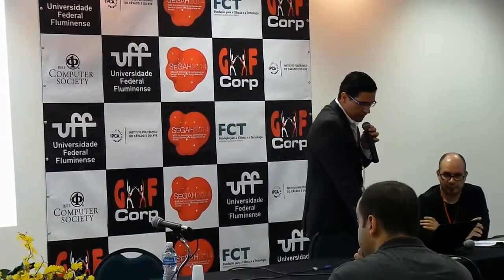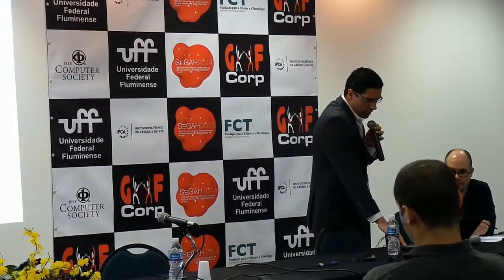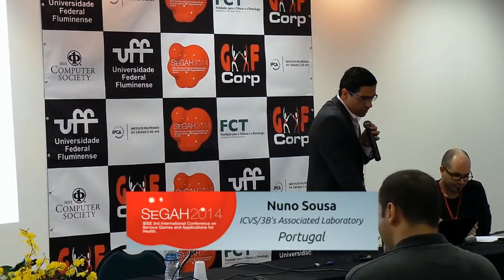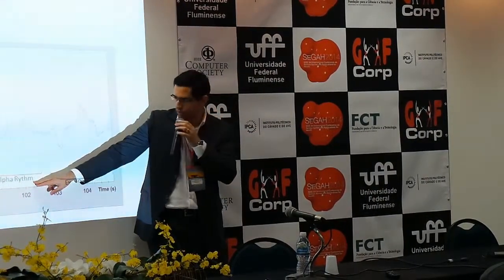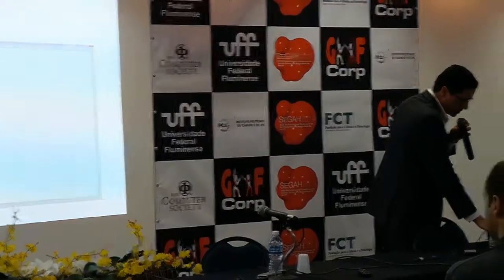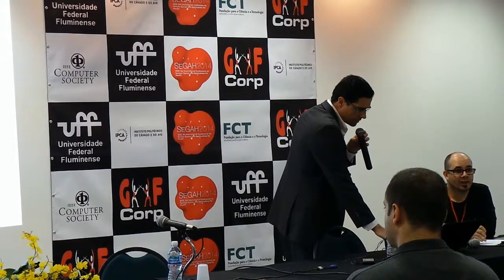that we have now. We also developed the visualization system for this data, based on the C# language, and we were able to validate the system by using the very common paradigm for EEG detection, which is eyes closed, eyes open. You can see the respective signal, and during the eyes closed phase, you can see the alpha rhythm, which is really the watermark for EEG. Okay, so this is an artifact. This is also very easy to detect.